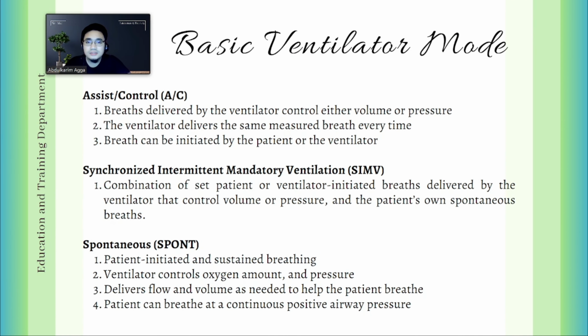Now, basic setups. I always discuss this to our new nurses because this is very important, as patients can have ventilators at home as well. There are really a lot of ventilator modes that you can see, but we will only discuss three of them now, because these are the three most important ventilator modes that you need to remember or understand. You have your AC mode, or assist control mode. You have your SIMV mode, which is synchronized intermittent mandatory ventilation, and you have your spontaneous mode.